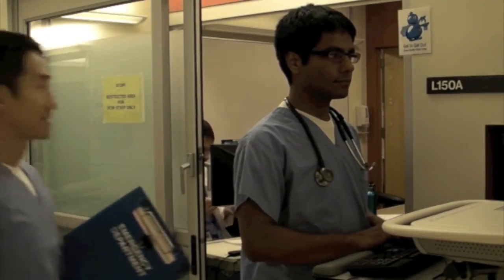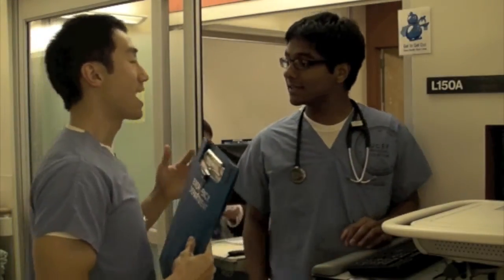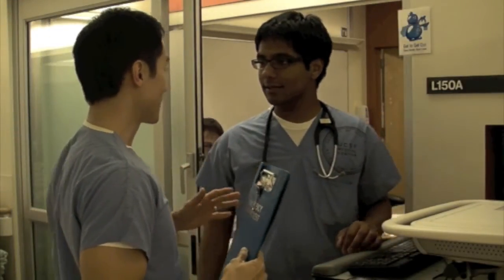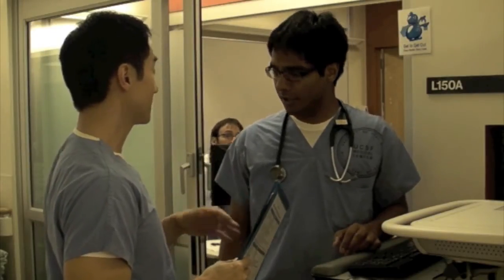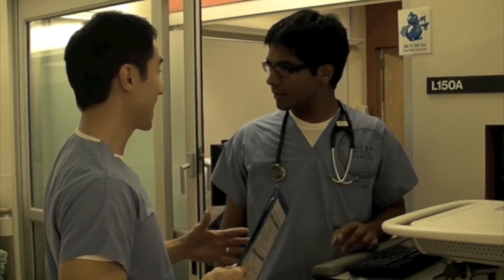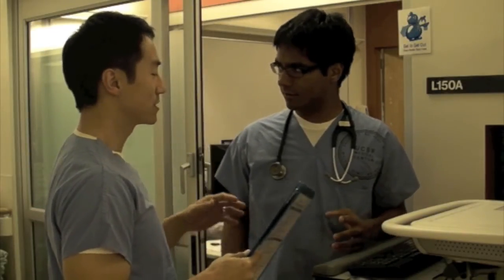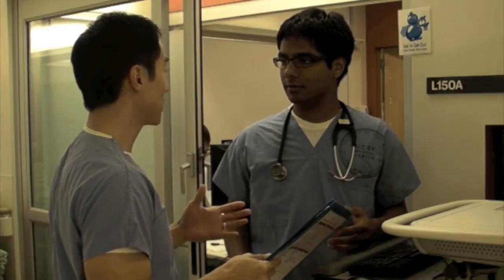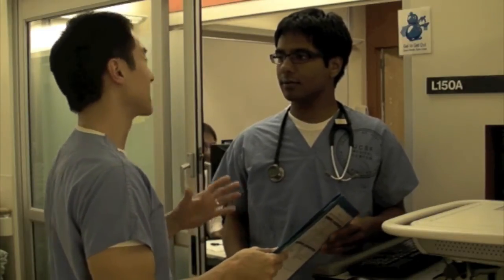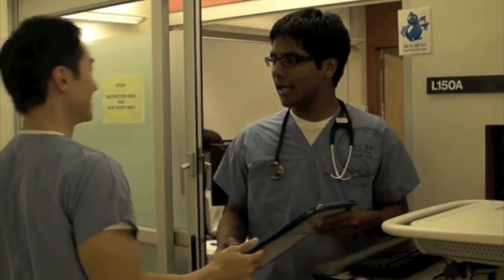Hey, Nazem. Hey. I am totally swamped right now. I need you to see this patient in room 9. Eye pain, red eye, can't see out of it — so just do a slit lamp exam, visual acuity, tonometry. It's really easy, you'll be fine.